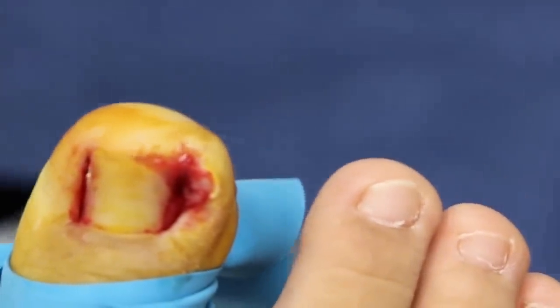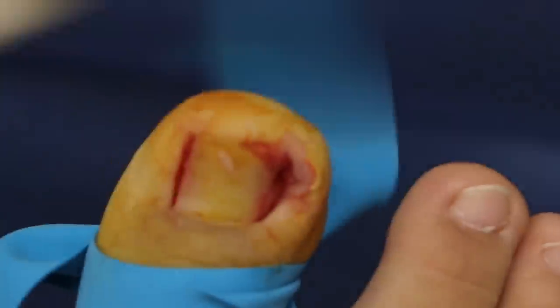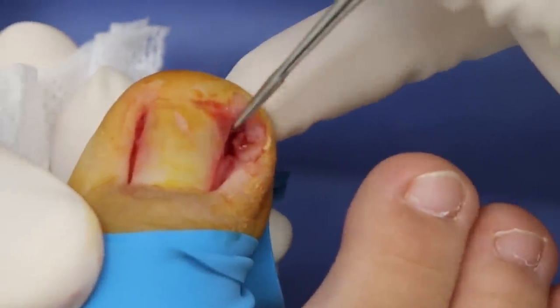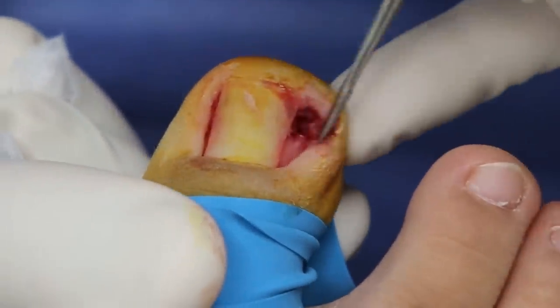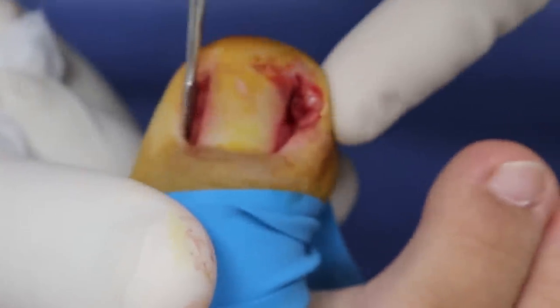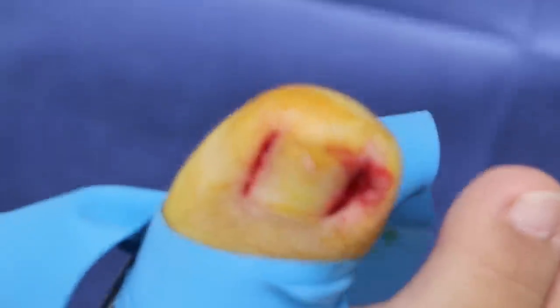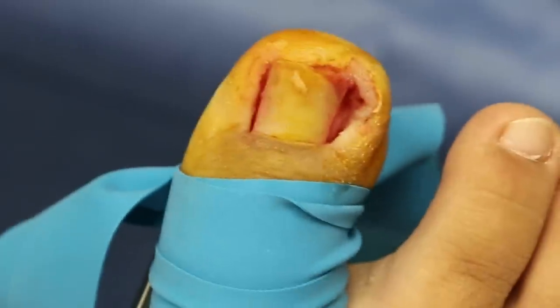If you just do this and don't do anything else, those corners will grow back. The difference is we're going to put that medicine — the acid — in the corners to stop them from ever happening again. You can see that fleshy part where the nail was stuck in the skin. We can see how it's really soft and fleshy because the nail was digging right in that corner. So at least on this side, we're taking care of it before it gets worse. Now we're going to put on that acid, and those corners don't grow back.